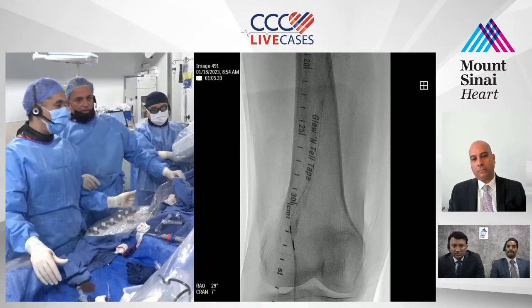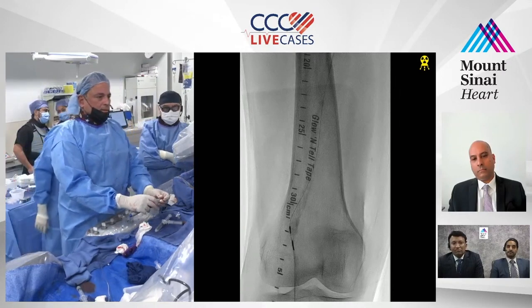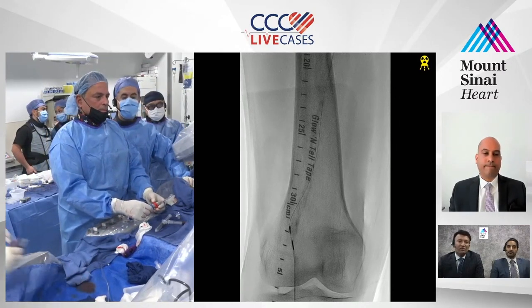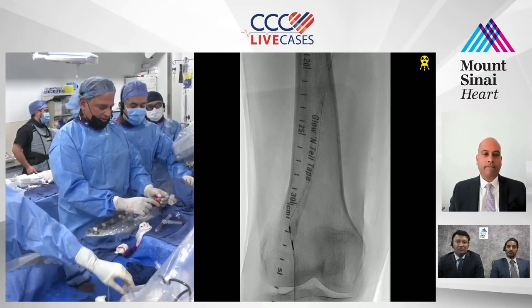Maybe find another plane. Yeah, let's just find another plane. All right, give me another command. No, but you can't take the wire out. You have to take the wire out. Do it. This is not Outback. No, you can. It goes through the back, guys.